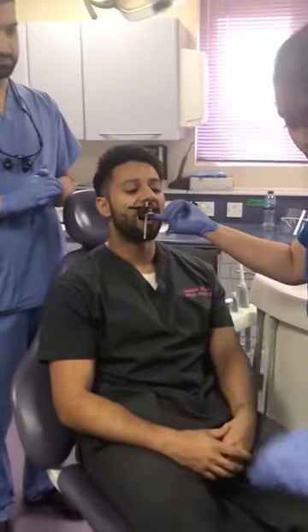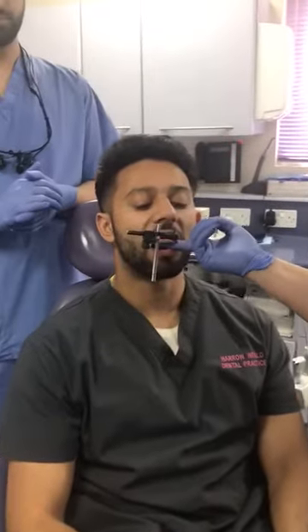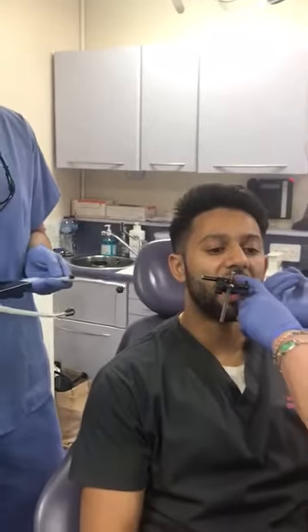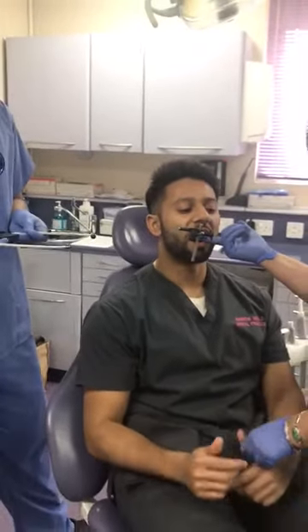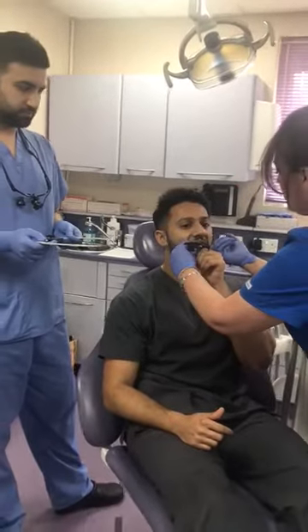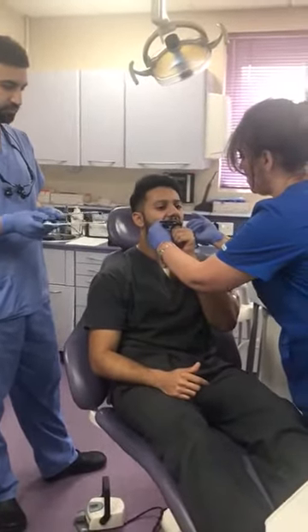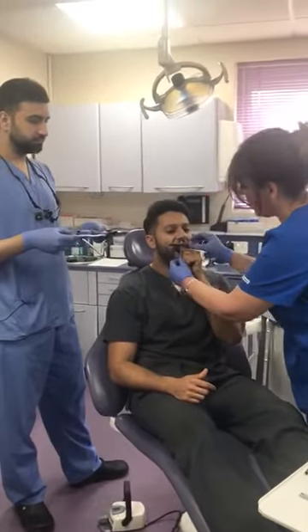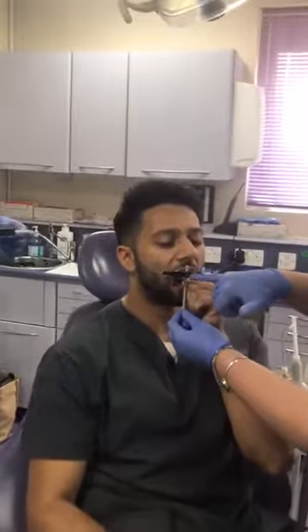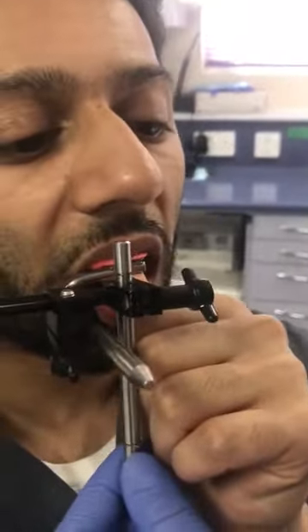Once it's set, Adam is going to help me with that. Can I ask you to put your thumb just underneath the bite fork where my finger is and just hold it there. Now there are two numbers on the jig — it's very important that both numbers face you when you're putting the face bow on the patient.